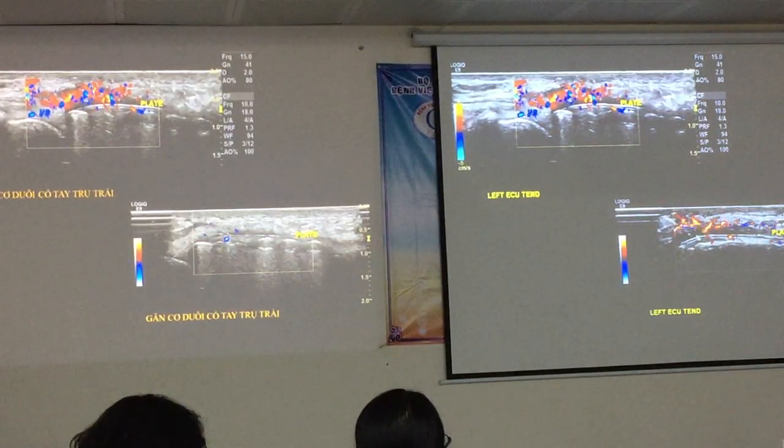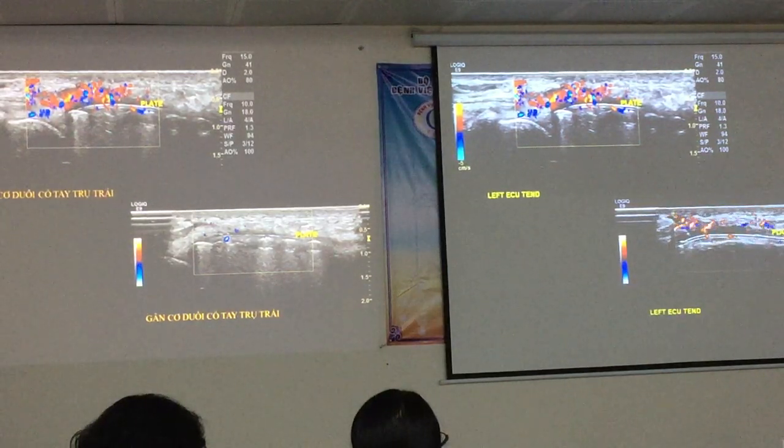But once again, there's quite significant hyperemia around that plate.